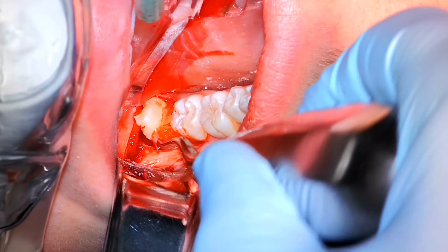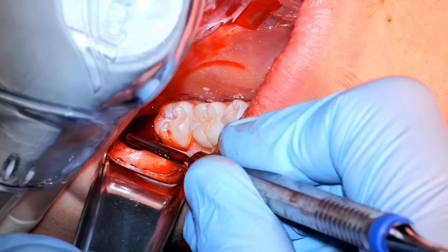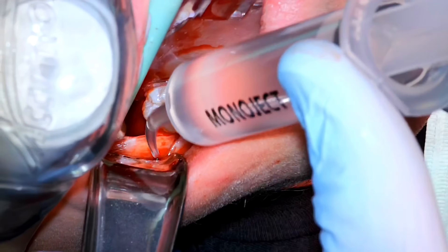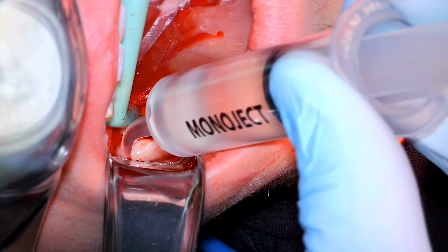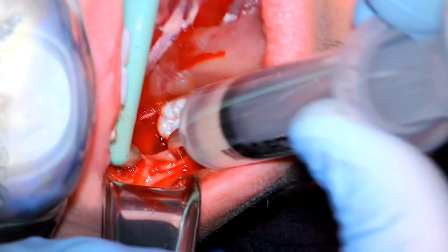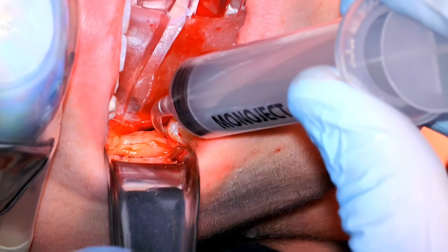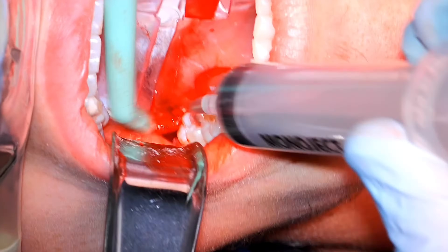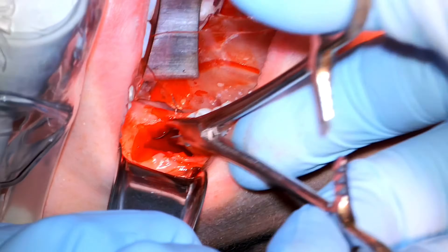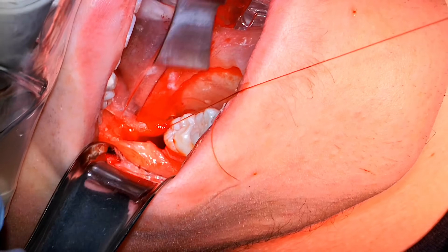Once you pry these out, the buccal is usually the place to go — you can kind of lift them out the rest of the way. Then we need to get back in and curet the socket, make sure there's nothing left in there, and give it a really good flush underneath that flap. Envelope flaps are nice for irrigating because that little envelope catches any debris — it's a nice spot to run the syringe through, so it tends to be a little easier to clean up. You can see how nicely the flap lays down when you're done — it's a nice approach.